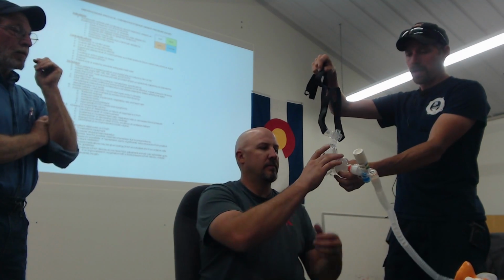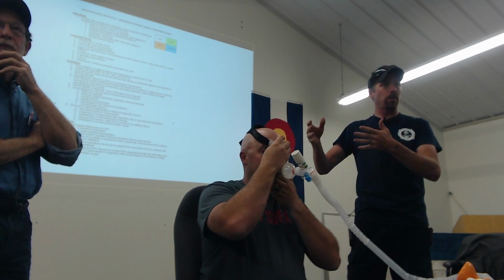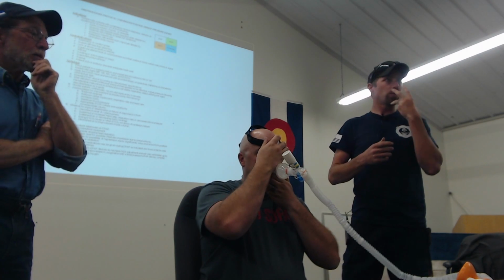Then we're going to coach our patient, and we're going to start by placing the forehead of the mask on there. It's even good if the patient is willing, just hand them this thing. You just manage the straps. I'll go ahead and hand this to you, and I'm going to coach you through it because if they feel like they're in control of what's on their face, it's going to be a lot smoother process than if you put it on them. Same goes with anything we do.